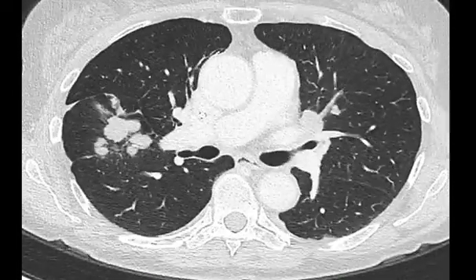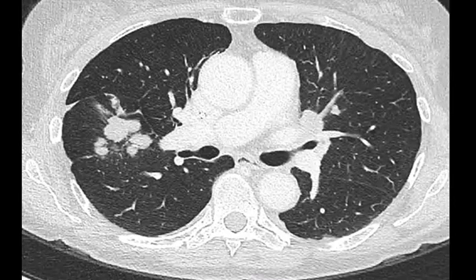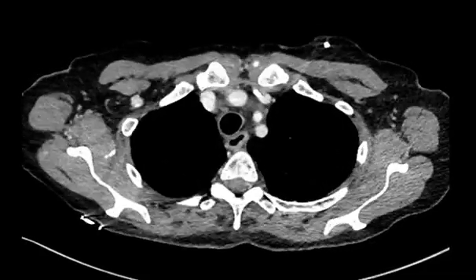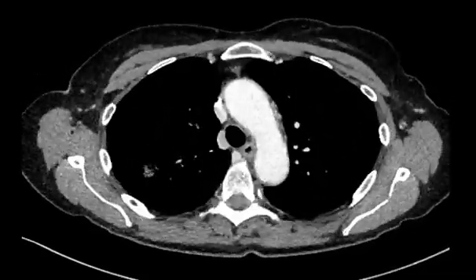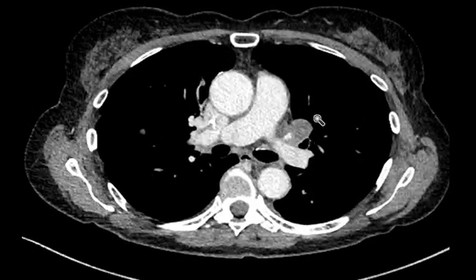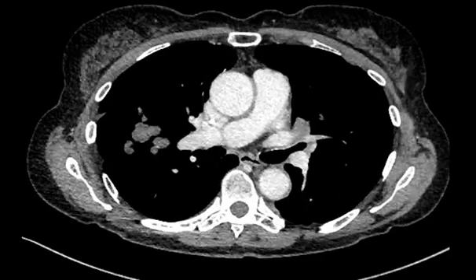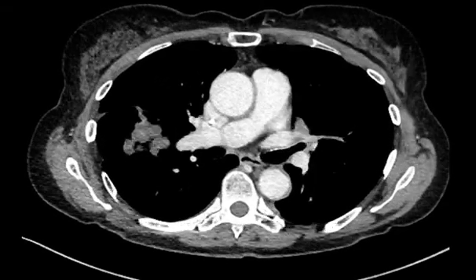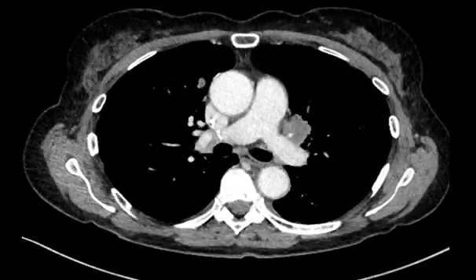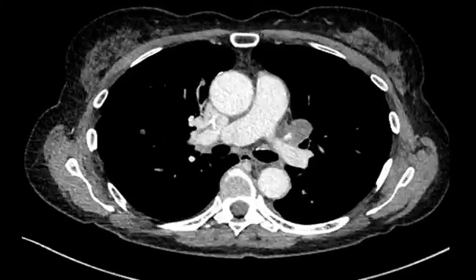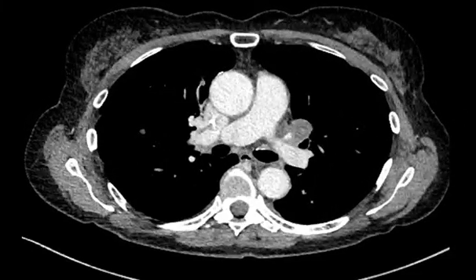On the left, there's a left hilar lesion. This is better seen in the mediastinal windows. If we scroll down through the mediastinal windows, you can see the left hilar lesion in here. This is a difficult area to access. We won't be able to access it with a linear EBUS scope, because that can only reach to about here — it'll be beyond the linear scope. There's not really an airway leading into it, so I don't think it would be amenable to radial EBUS either. It may actually be a lymph node metastasis, I suspect.